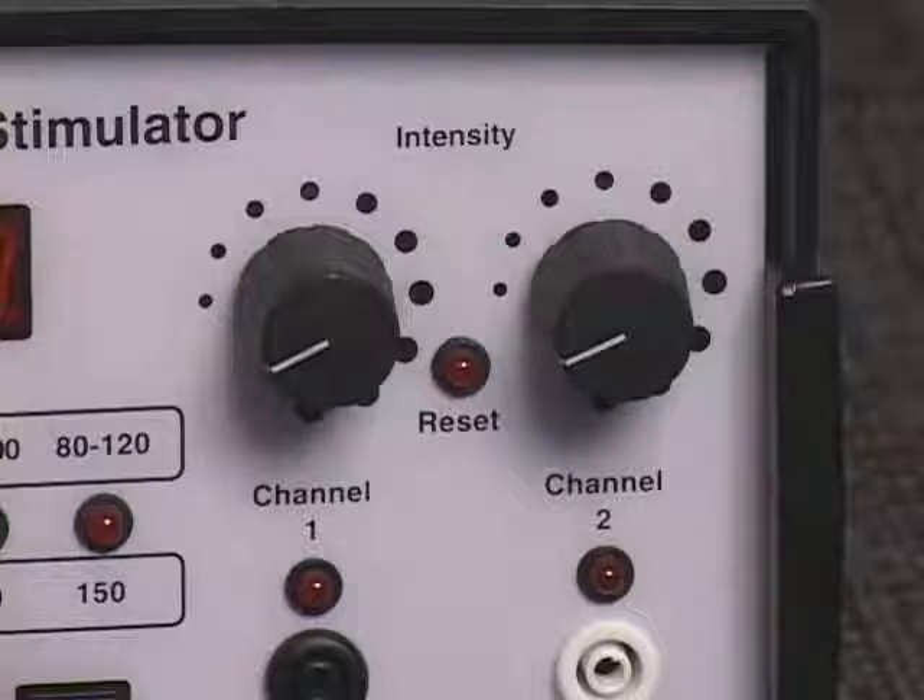The IF-150 is equipped with an intensity reset circuit feature. This feature prevents the practitioner from applying one patient's intensity setting to another patient.